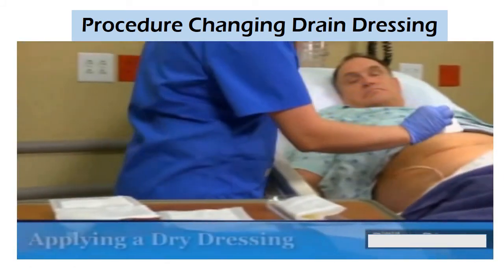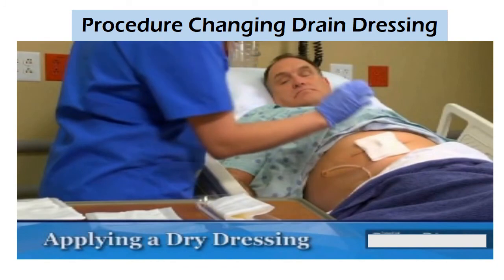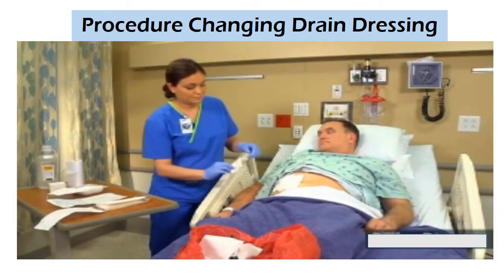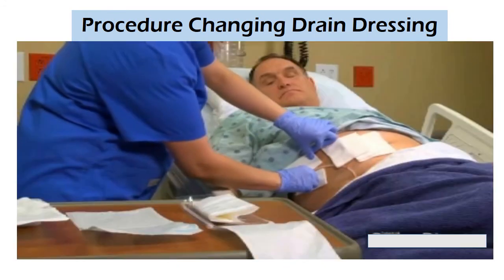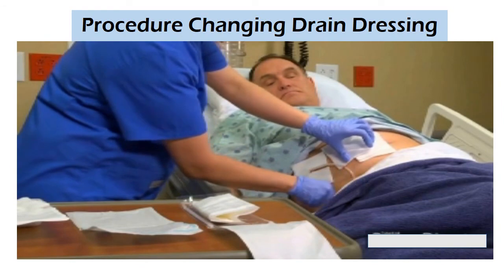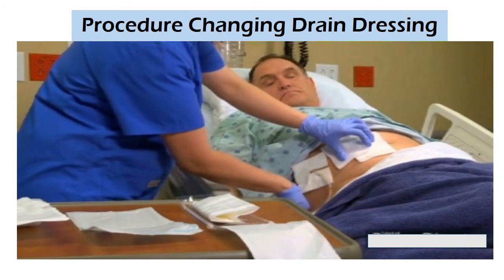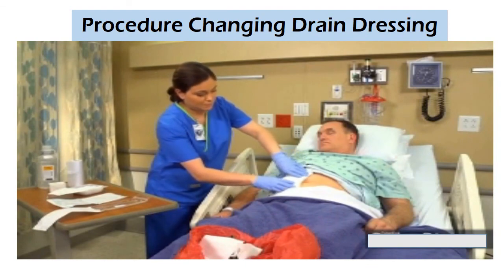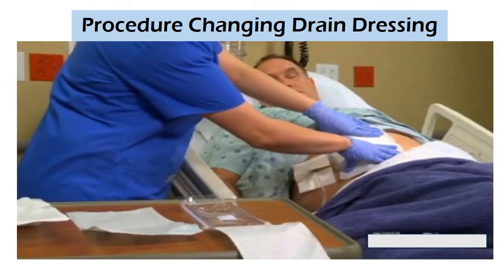To apply a dry dressing, use loosely woven gauze as a contact layer. If the wound has a drain, place a pre-cut 4x4 gauze pad so that it sits flat around the drain. Apply additional layers of gauze as needed. On top of this, apply a thicker woven pad, such as a Surgipad or abdominal dressing.